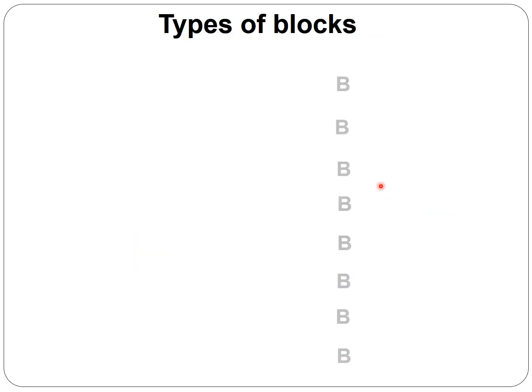The types of blocks. When we examine a connection between 2 points A and B, we are going to evaluate how fast the depolarization spreads from A to B. Normally, this takes a certain time. We know that, for example, in the AV junction, we have a connection between the atrium and the ventricle where the PR interval ranges from 0.12 to 0.2. This is the normal range.